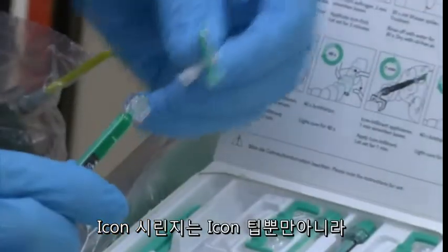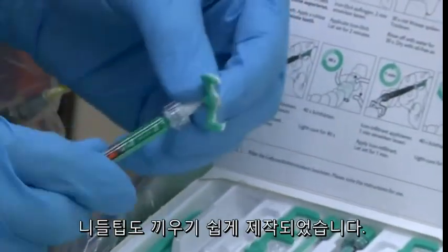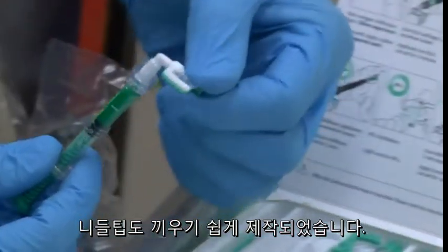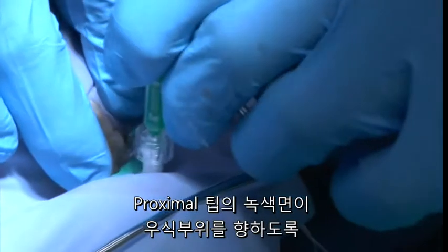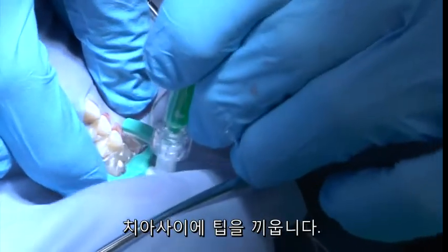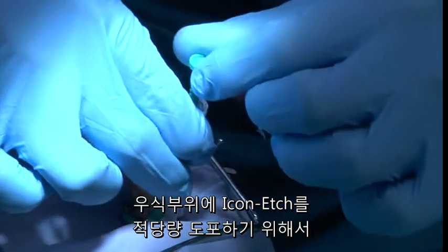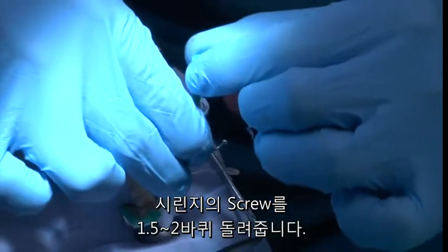The Icon etch syringe is attached to the proximal tip with a luer lock connection. Place the applicator tip into the treatment area with the green side towards the lesion, and slowly turn approximately one and a half to two times so that an adequate amount of gel is dispensed and covers the lesion site.